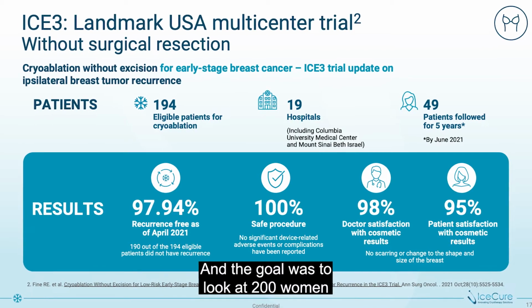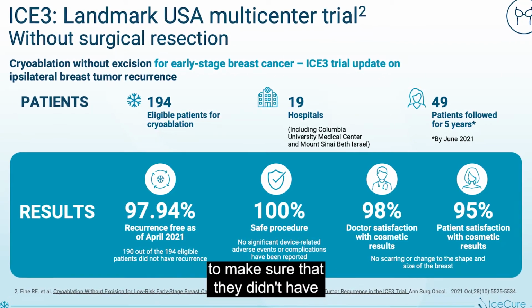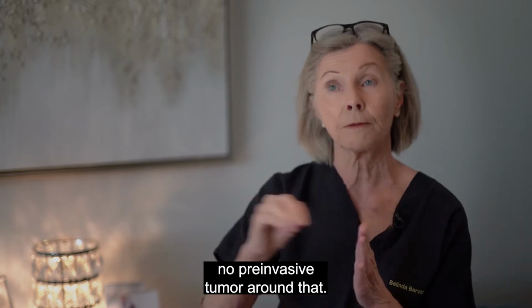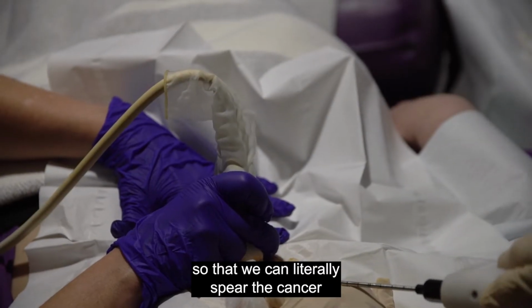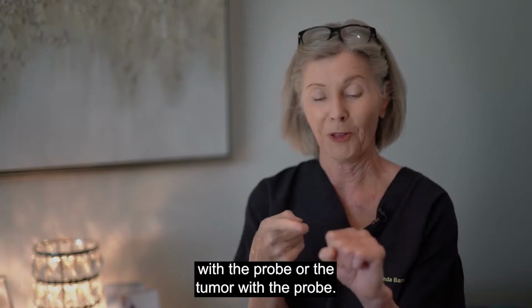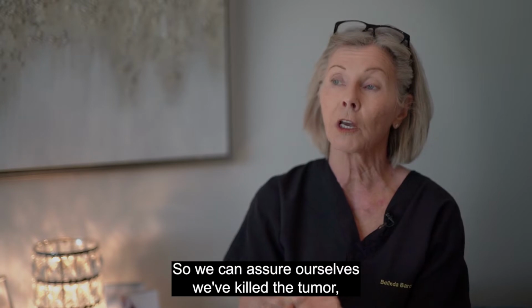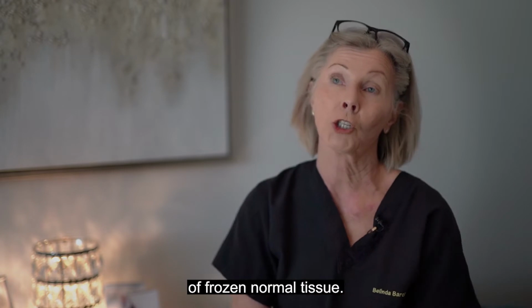And the goal was to look at 200 women following treatment with cryoablation to make sure that they didn't have recurrent tumor in that area. We've studied small invasive ductal cancer, no pre-invasive tumor around that. They have to be easily visible on ultrasound so that we can literally spear the tumor with the probe, and grow the ice ball around it as we're watching real time. So we can assure ourselves we've killed the tumor and we have a clean area all around it of frozen normal tissue, so we have a margin.